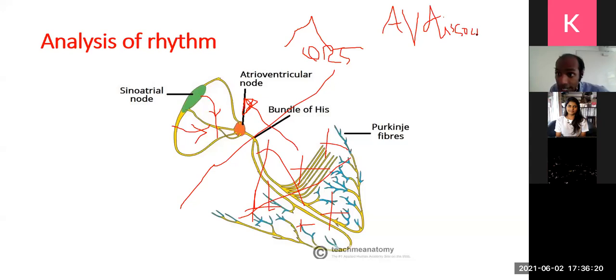I will show this and explain this again, but remember for the moment, in a ventricular rhythm, the QRS is completely abnormal or odd shaped because it's just very haphazard ventricular depolarization. But the current can't go in reverse. The sinus node is functioning independently and is dissociated. I will explain this again. So this is essentially what you mean by rhythm. Then I will summarize.